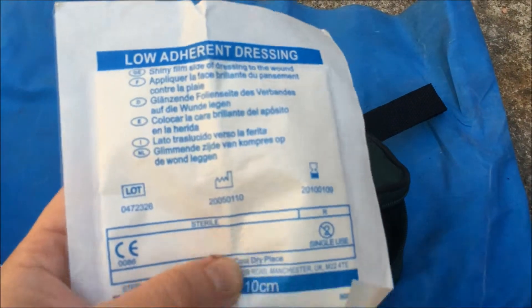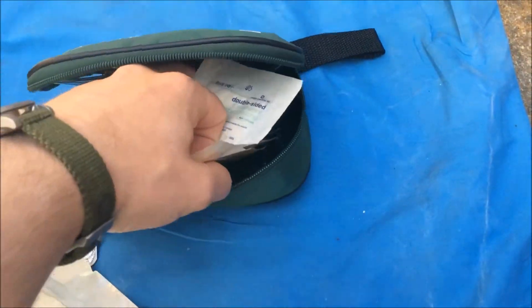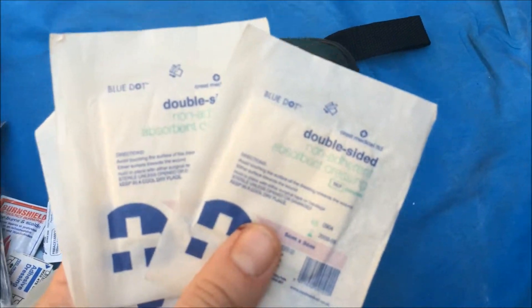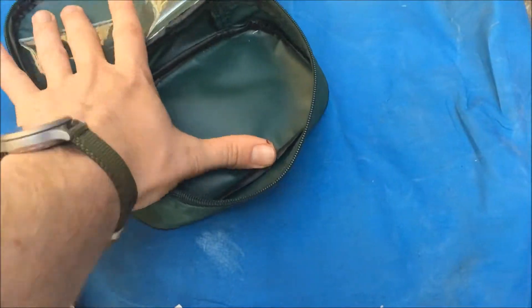Then we just come to these few dressings at the end — non-adherent or low-adherent dressings. There's a large one, 10 by 10, and I've got about three or four smaller ones. The kind of things you'd put on with tape or a bandage or something like that.